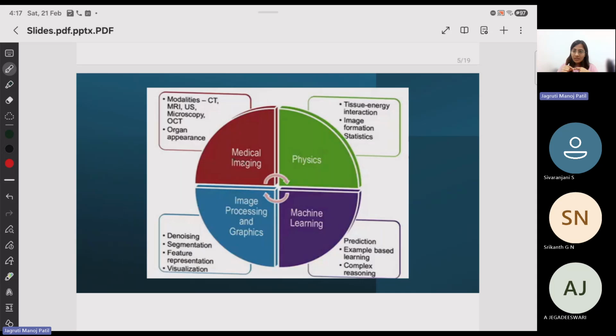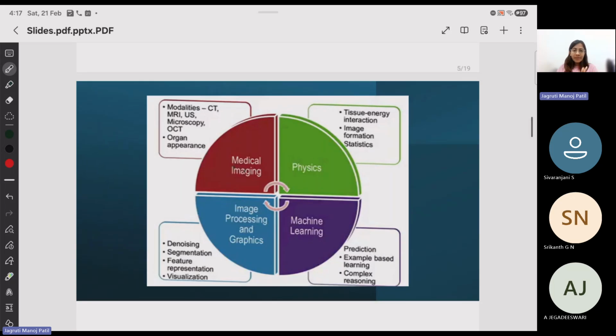Ultrasound needs a medium to propagate, it cannot propagate in vacuum. So everything in ultrasound will need water, or some coupler. A better coupler is nothing but water for most of the imaging systems. But every time you do ultrasound you won't have water around, or go into a tank of water, an aquarium or something, to get yourself a sonography image.